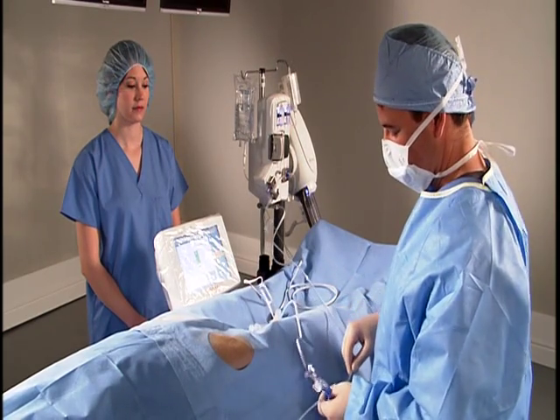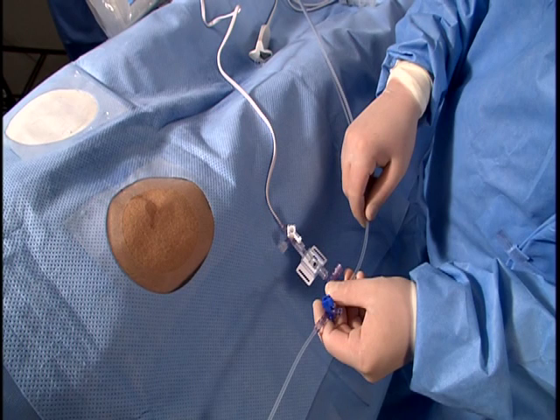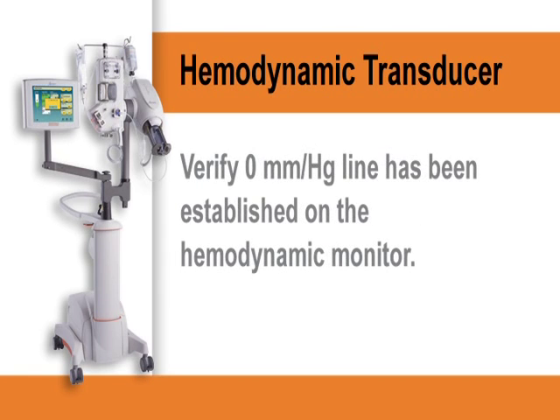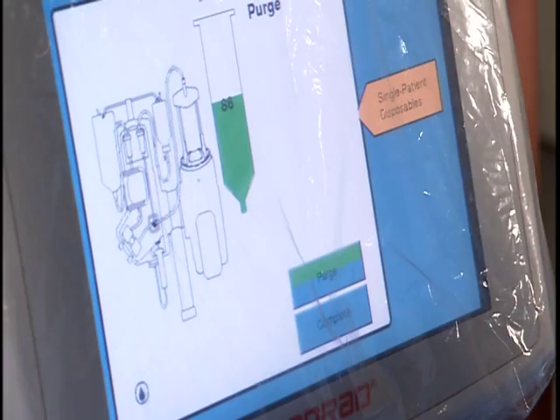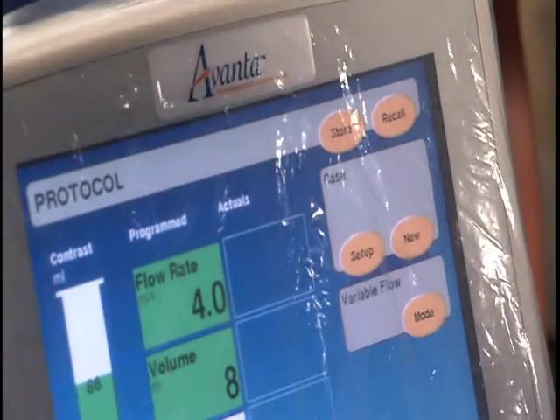Verify that the waste port stopcock is closed to the waste port and open from the PIV to the patient. Then hold the PIV assembly with attached transducer parallel to the patient and level to the heart. Press the hemodynamic monitoring system zero transducer button. Verify 0 millimeters of mercury line has been established on the hemodynamic monitor. Finally, touch Complete, then touch OK.